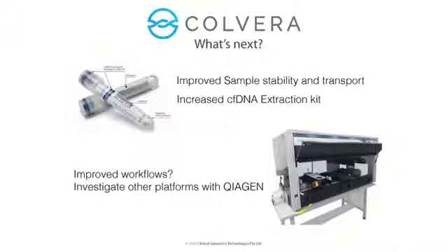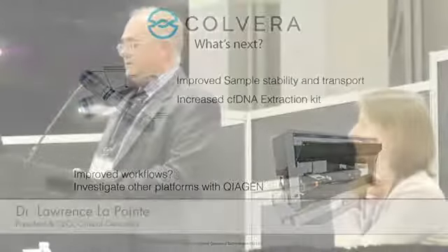A very important point that is critical to circulating tumor DNA testing is this issue of patient sample stability. It'll be obvious to many of you, but when you're looking for circulating tumor DNA, or free circulating DNA, whatever you want to call it, you really don't want to be contaminated by white blood cell DNA that sometimes is lysed in specimen handling. So we're really excited about some work to develop an improved sample stability kit with QIAGEN to take away that problem of having lots of relatively unskilled pipetting in the field. I think this is a big step forward.